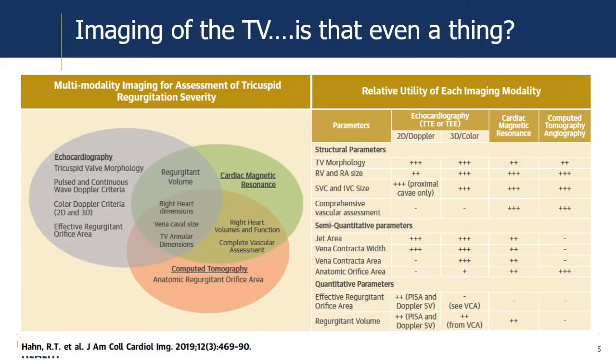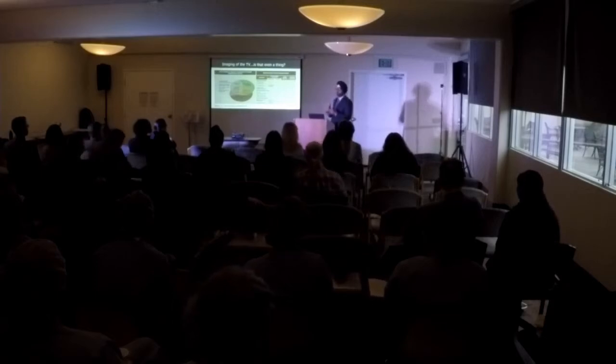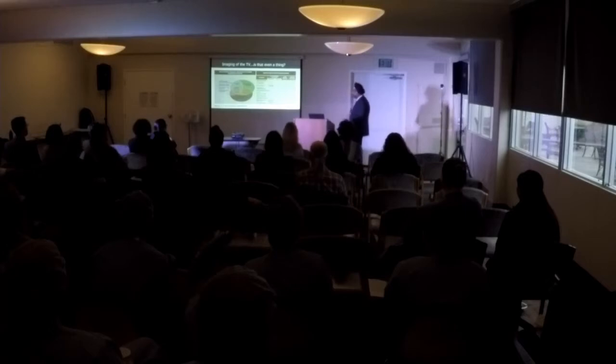And it's not just echo. You're going to start seeing this more and more, especially for patients with structural heart disease, not just for the aortic valve and mitral valve, but for the tricuspid valve too: there's going to be a lot more emphasis on the use of CT and cardiac MR to quantify the regurgitation and the effect that it has on the supporting structures, predominantly the right ventricle. And then you're also going to talk about tricuspid annular dilatation, and it'll allow you to assess a lot more when you're able to do it completely with CT and cardiac MR, and echo will be there as well. But really it's a Venn diagram of multiple imaging modalities, and all of them help to answer different questions and give you a much better understanding of what the pathology is and where patients will benefit the most.